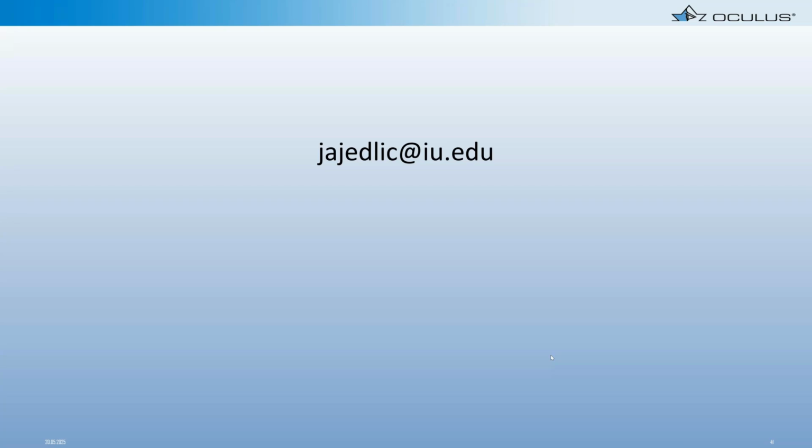Sure. So again, a couple things. One is, do we have a family history? If we talk to not necessarily always the patient, but maybe a parent if it's a child, and say, did anybody in your family that you know of have this disease keratoconus? Have you ever heard of that? And they say, oh yeah, we've got someone in the family with that. That of course is right away a serious yellow flag, if not a red flag to me. If we've got a questionable map and a family history, I'm probably steering away.